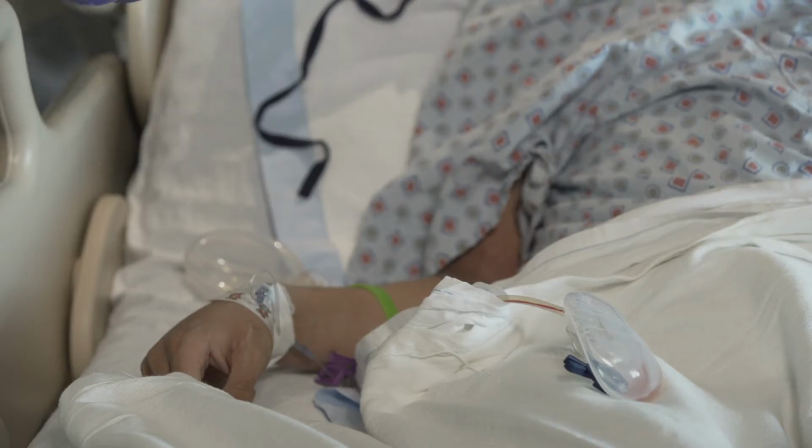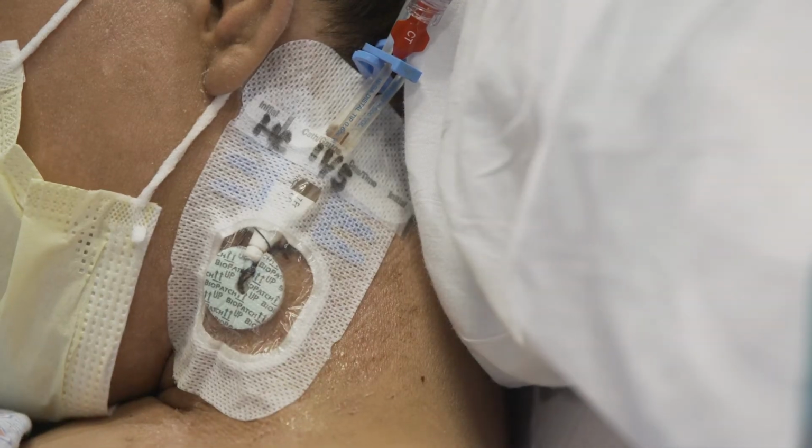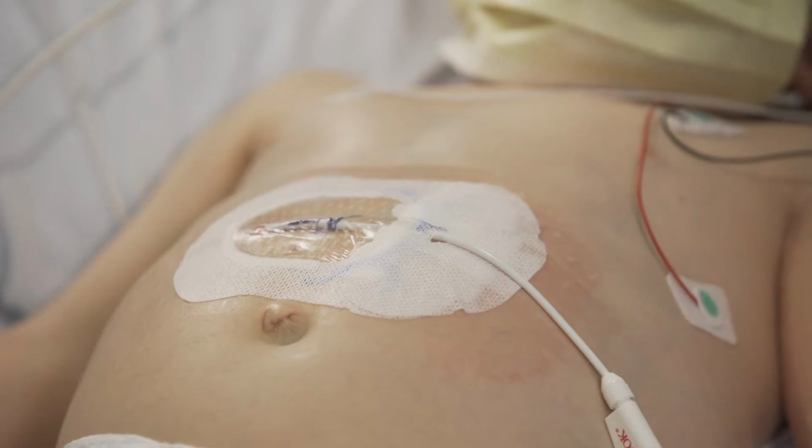Getting ready for your transplant can seem like a daunting challenge. We want to take some of the uncertainty and mystery away from it by letting you know what to expect after your transplant. Children have JP drains, central lines, and sometimes require drainage catheters called PTCs, or percutaneous transhepatic catheters. Our nurse educator, Marci Czachowski, is going to show you what those look like and what to expect.